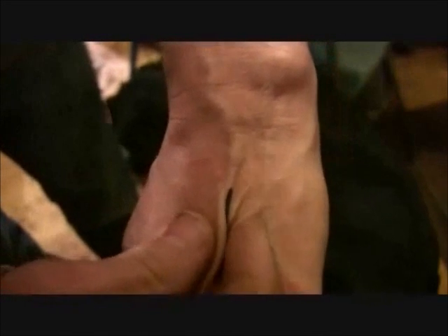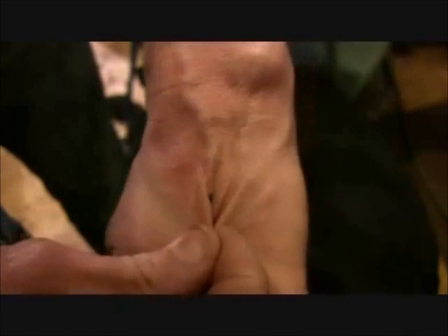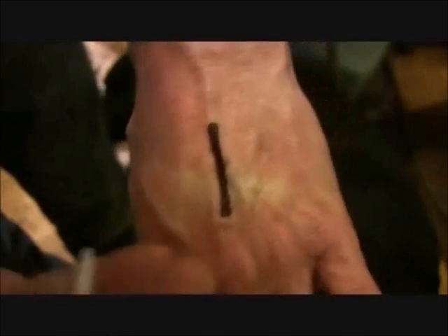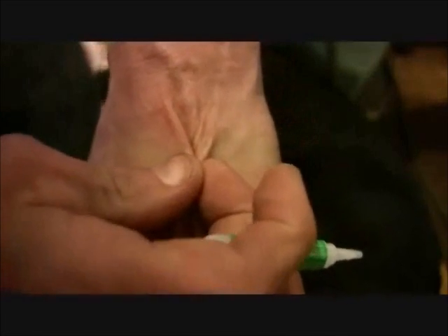So you essentially just pull the skin together like that. You want to make sure that the cut is in the valley of the, like you make a little taco, right? That's essentially what you're doing. You just want to make sure that this is in the valley of the taco. So you just pinch it together, and it should hold. But it might pop open.